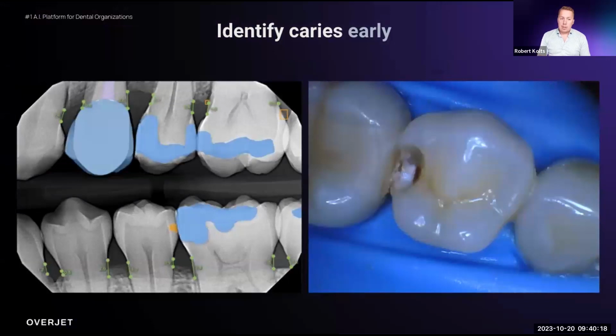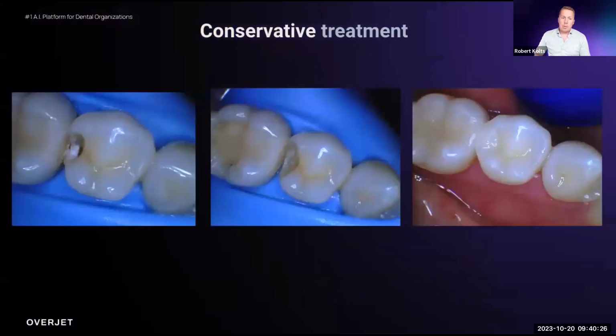And so here's his rough preparation. And you can see that sure enough, there's caries there. And absolutely, it's beyond the DEJ. Okay. And so then he went on to restore, then got a nice restorative outcome for his patient. But think of what happened if he hadn't diagnosed that. Would it have been the end of the world? No. Okay. Hopefully you would have caught it next time.